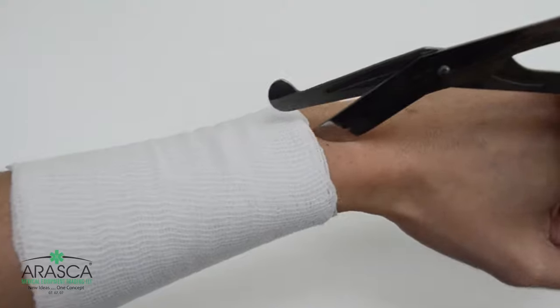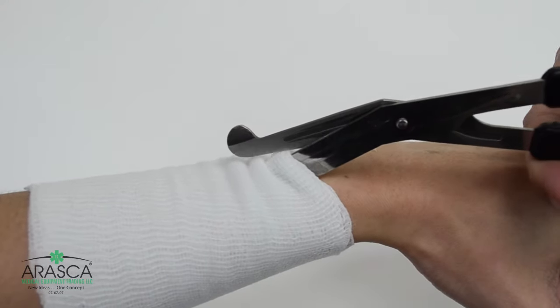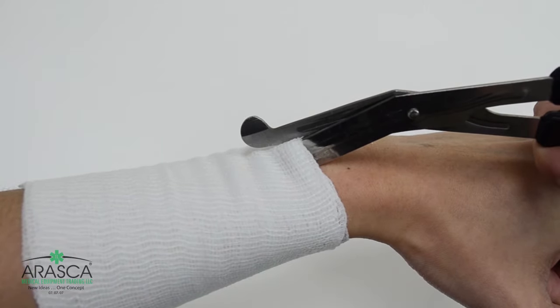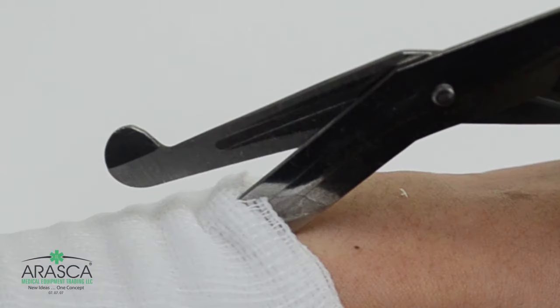Shears and scissors are used to cut bandages and tape. Some first aid scissors are designed to easily slide on bandages and prevent tearing of the patient's skin during treatment with their rounded edge.